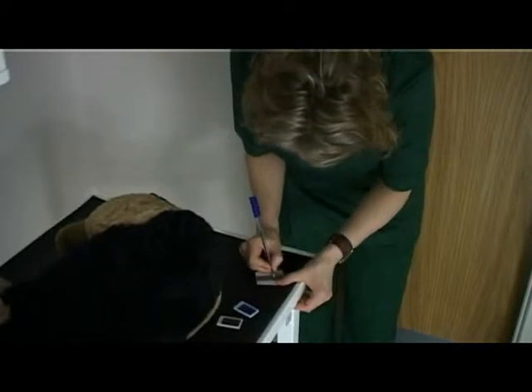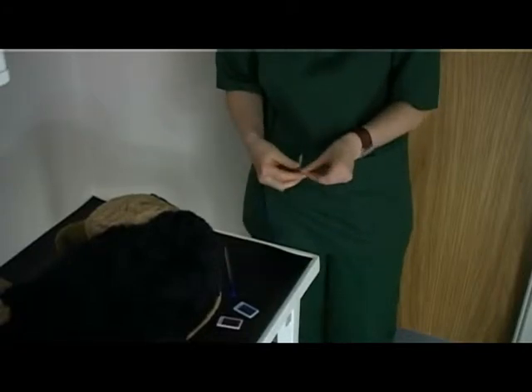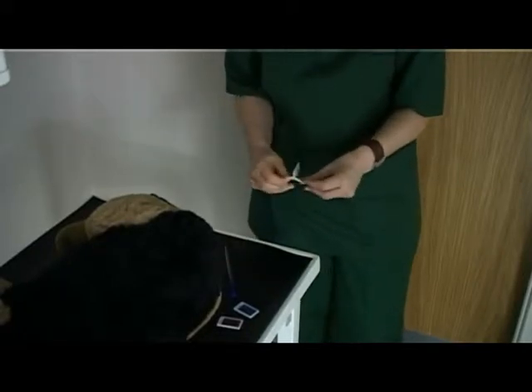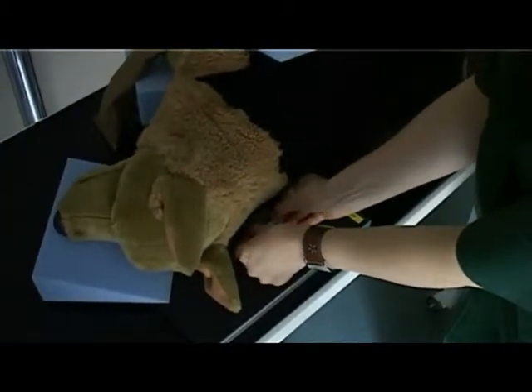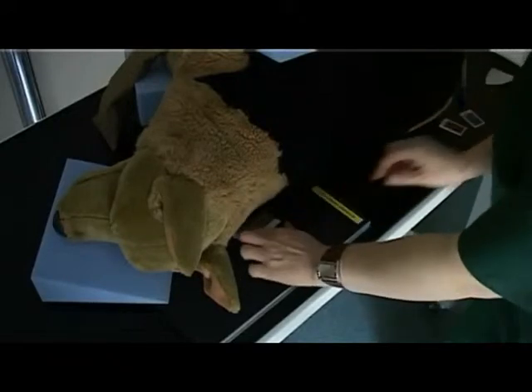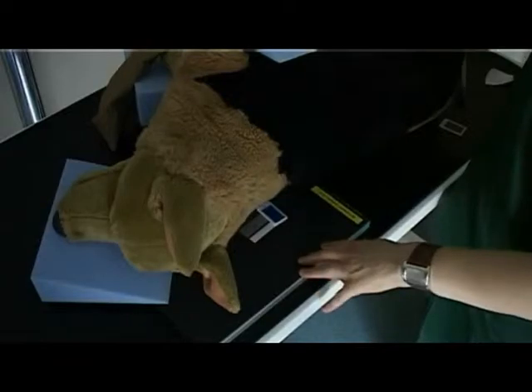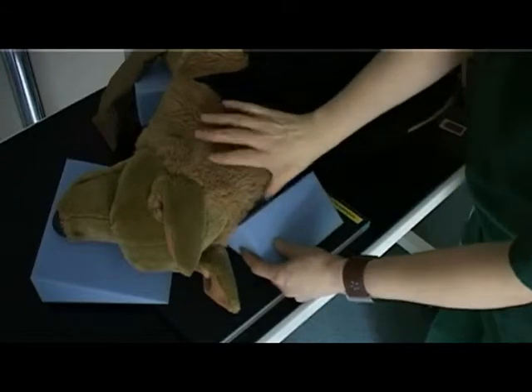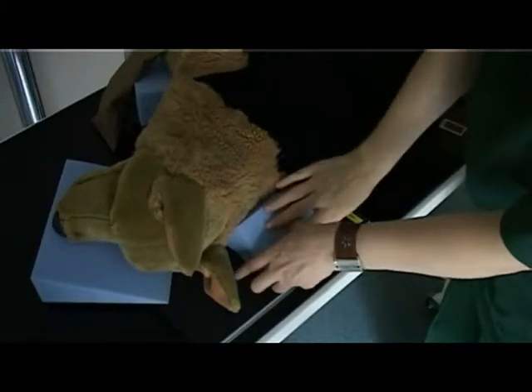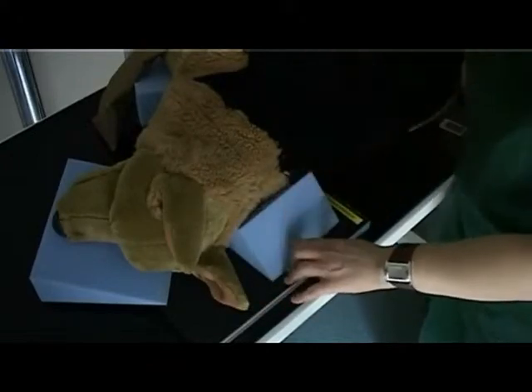Label with the patient identification and date and place within the primary beam. Place the left marker correctly within the primary beam. You have now correctly positioned the patient for a left lateral survey view of the cervical vertebrae, including all necessary equipment.